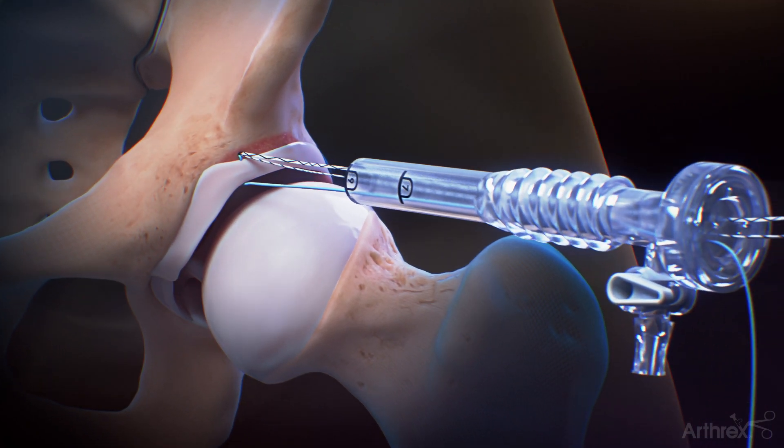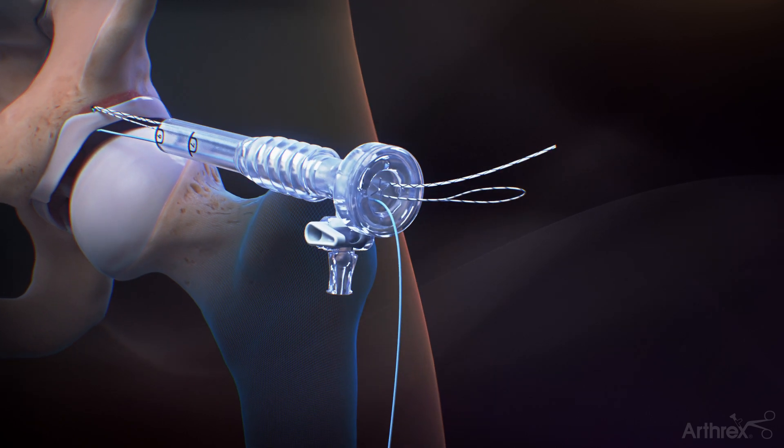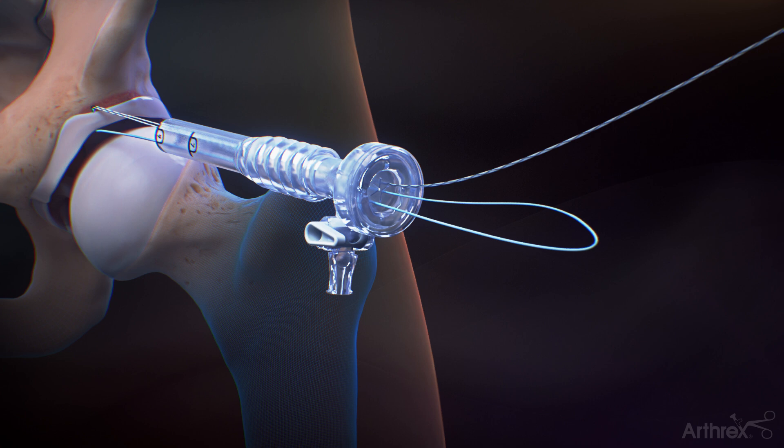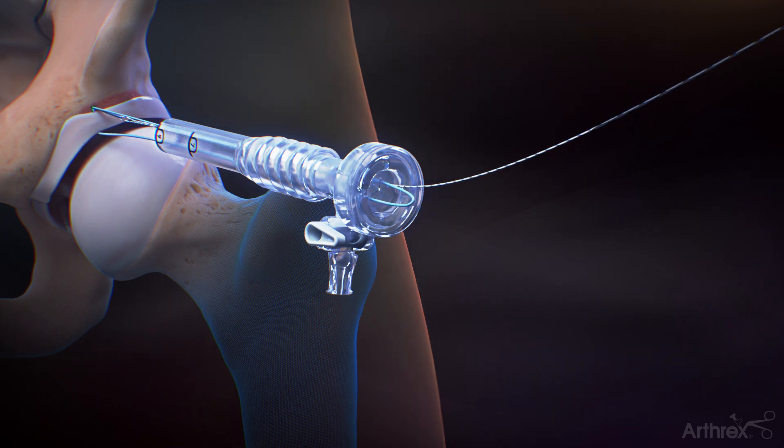Outside the cannula, load the repair suture through the loop of the shuttle suture and crease it at the blue mark. Pull the suture tape end of the shuttle suture to pass the repair suture back through the anchor.